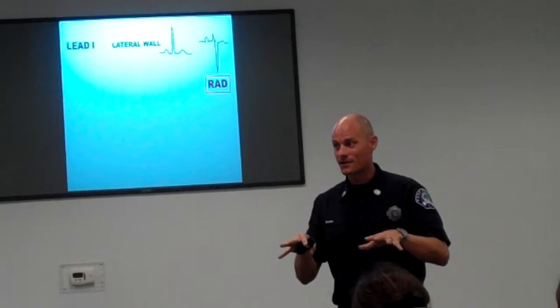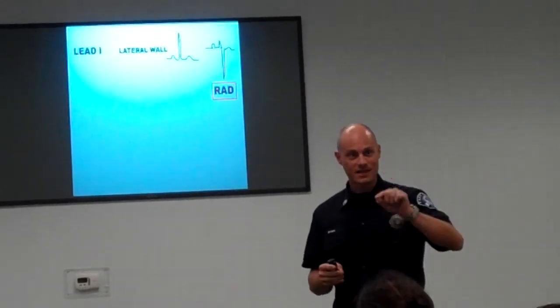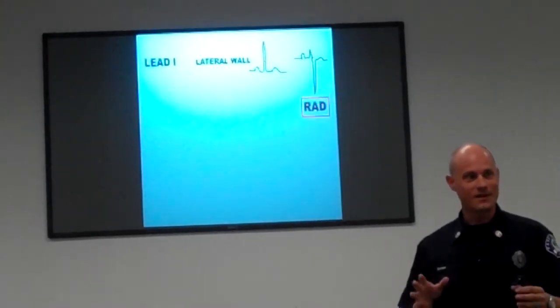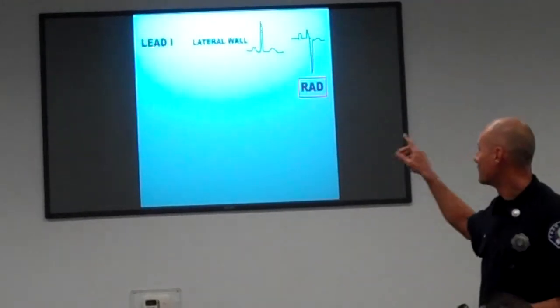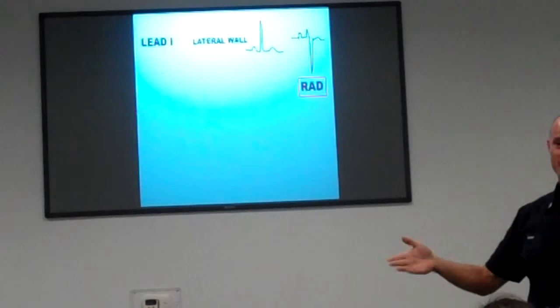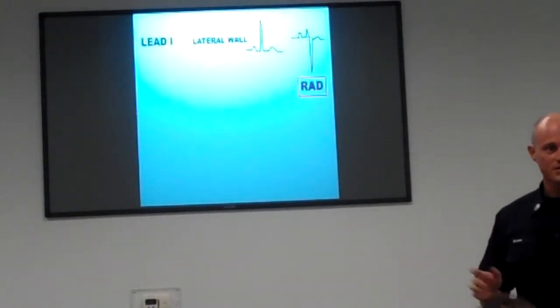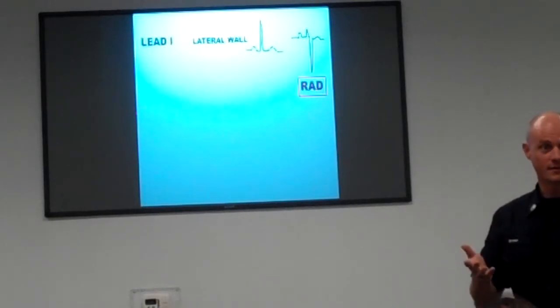For us as paramedics out in the field, it doesn't matter. If you have a negative deflection, they have a cardiac history. That's it. Okay? So that's kind of one of those little life hacks or paramedic hacks or whatever. If it should be up and it's down, they have a cardiac history. And we've all encountered those patients who say, no, I don't have a cardiac history. But if it's a negative deflection, they do. They do.